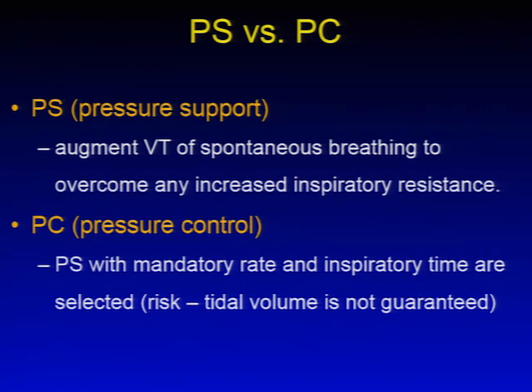Pressure support augments the tidal volume of spontaneous breathing to overcome any increase of inspiratory resistance. Pressure control is mandatory. It is pressure support with mandatory rate and inspiratory time selected. The risk of pressure control, again, is that tidal volume is not guaranteed.